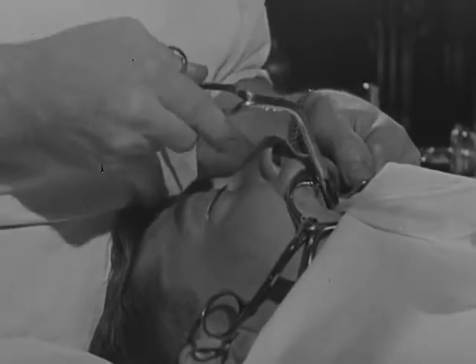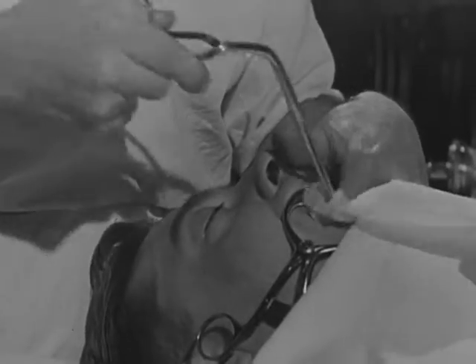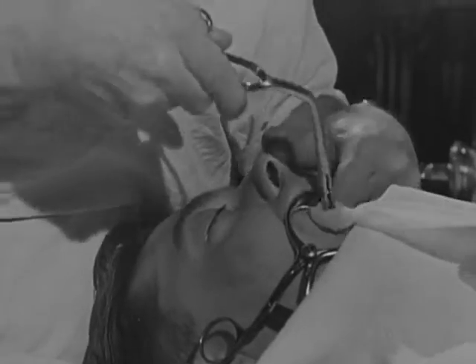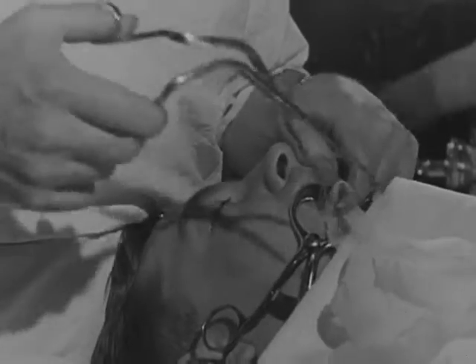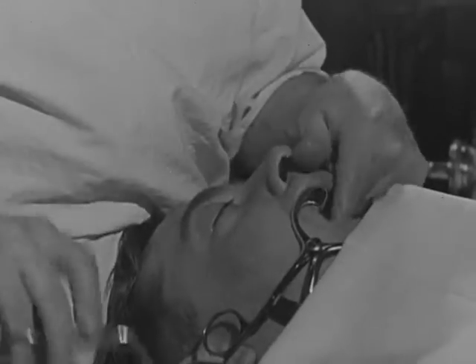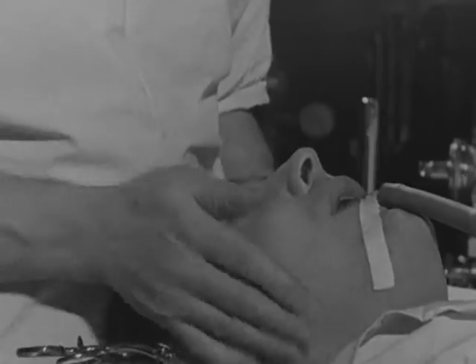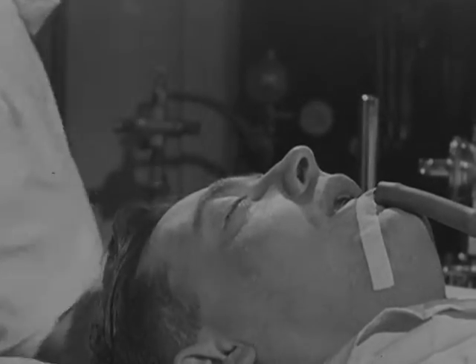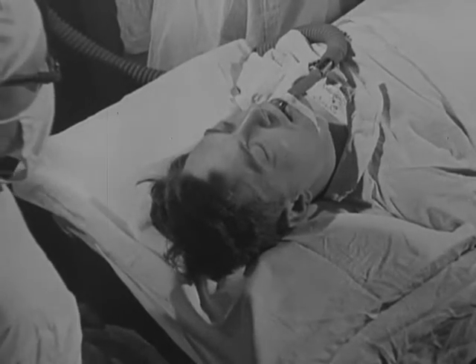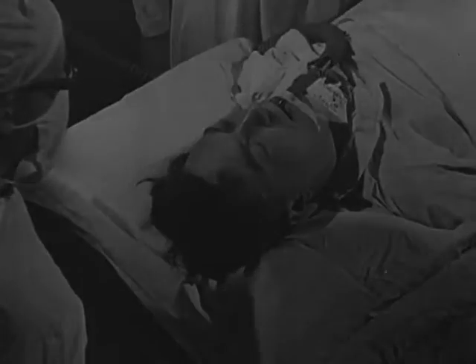Packing is deposited in such a way as to hold the soft palate against the posterior wall of the pharynx, thereby encouraging the soft palate to fulfill one of its natural functions. This method of packing is more satisfactory than putting in packs behind the soft palate and is less likely to lead to injury. No blood can now reach the trachea, and the packing also makes sure that breathing takes place entirely through the tube.